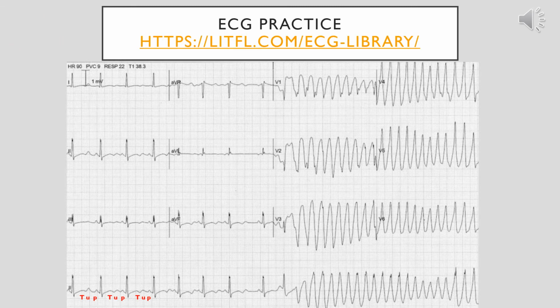Okay, moving on to this next EKG, we see a noticeable difference from the beginning of this 10 seconds to the end. We have a P wave followed by QRS over and over until we don't. Then we go into some VTAC over here to the right. You do notice that the waveform formation is that torsades de pointes that we talked about earlier, where the polymorphic changes go from really deep to more shallow to really deep again. This usually indicates some sort of electrolyte deficiency along with the conduction problem, and that this patient has ventricular tachycardia, which needs to be resolved through cardioversion shocking.